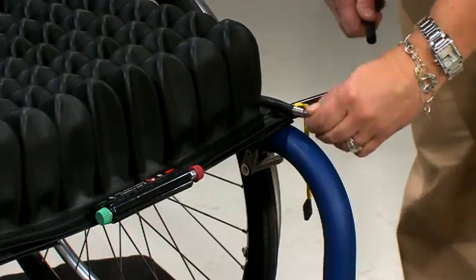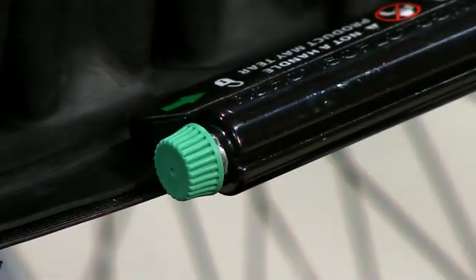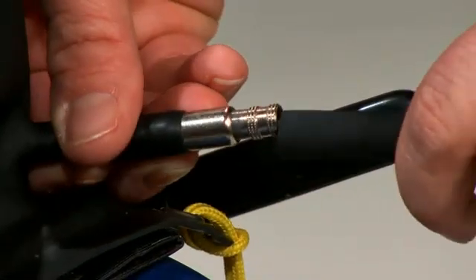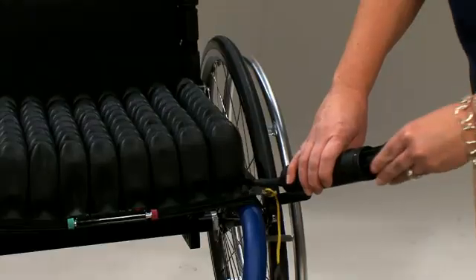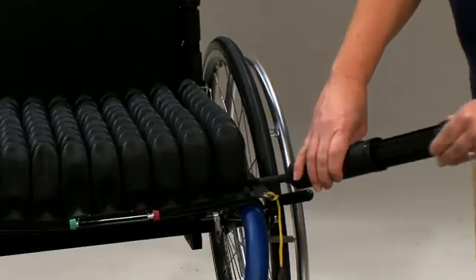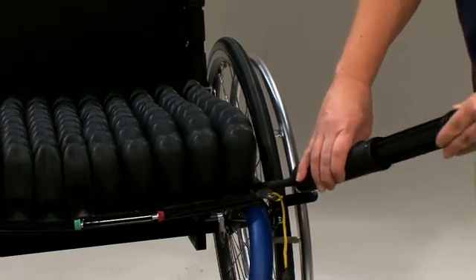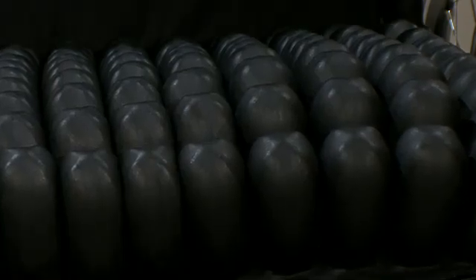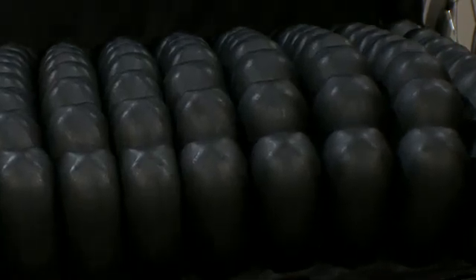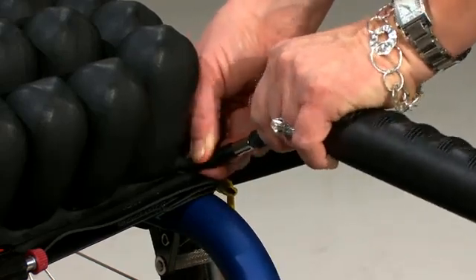Now turn air valve counterclockwise to open. Make sure the ISOFlow memory control is also open by pushing the ISOFlow's green knob to the right or unlocked. After opening the valve, slide the pump's rubber nozzle over the air valve and inflate the cushion until it begins to slightly arc upward. Please be aware that the air will travel to the closest quadrant first, then pass through the ISOFlow to inflate the other quadrants. This is why the first quadrant looks overinflated when you start the inflation process. After seeing the arching of the cells, pinch the pump's nozzle and turn the air valve clockwise to close.